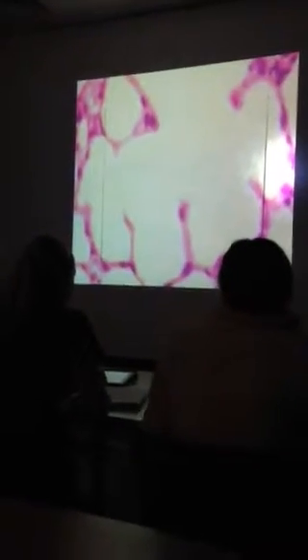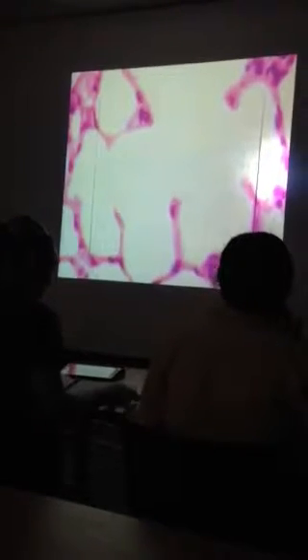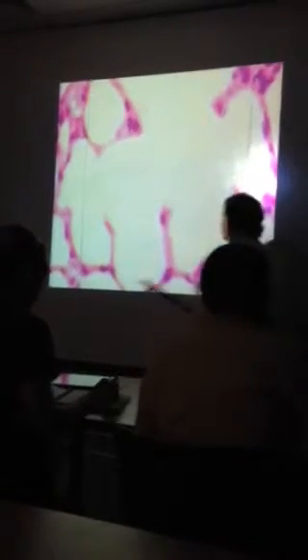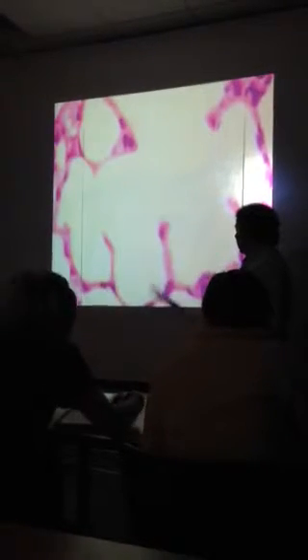All right, what organ are we looking at? How easy is that? How come you didn't know that on the pre-test? Exactly. See, you learned a lot, didn't you? What's this whole thing here? Alveolar sac. What's this little thing here? Alveolus, right?